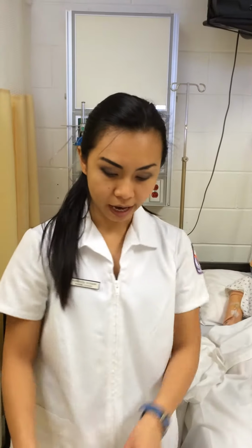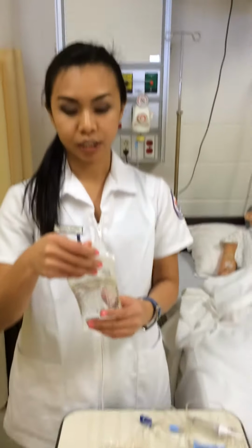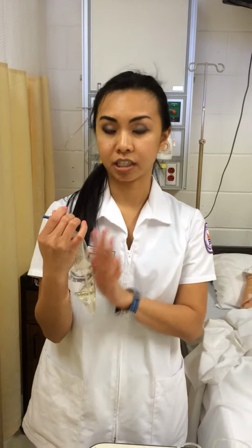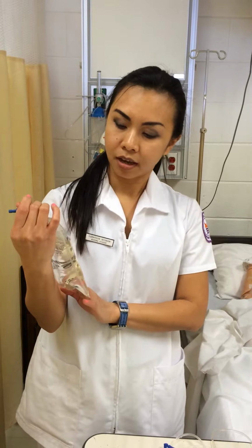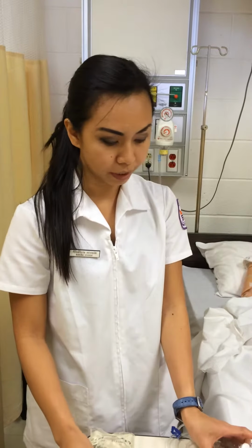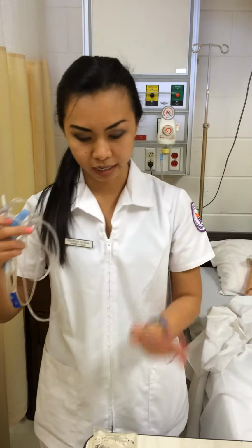Now my equipment, I have IV solution and tubing. So for the IV solution, I make sure it's not expired, it's the right solution, and the tubing. So I label the tubing, I label the solution.